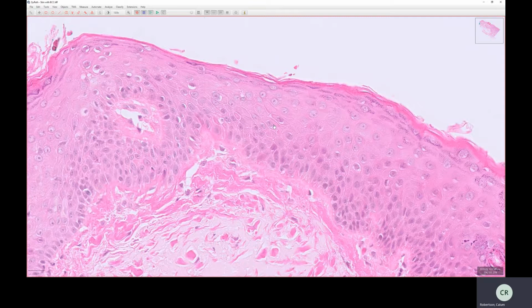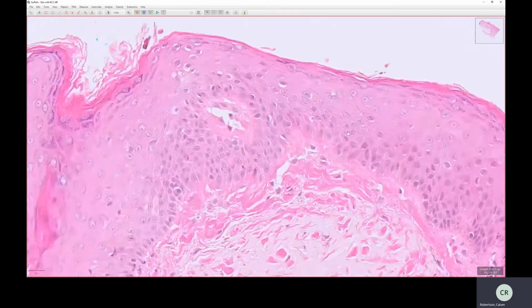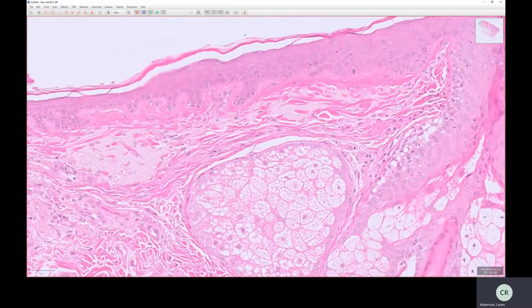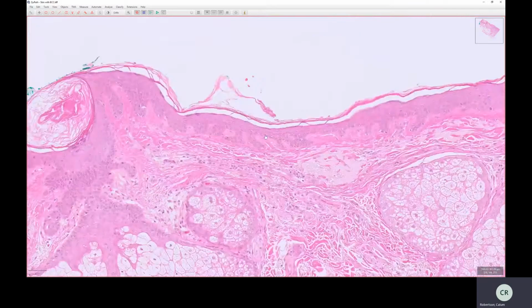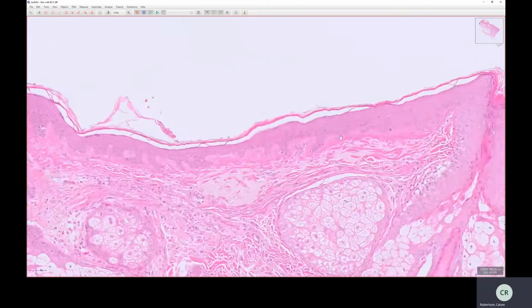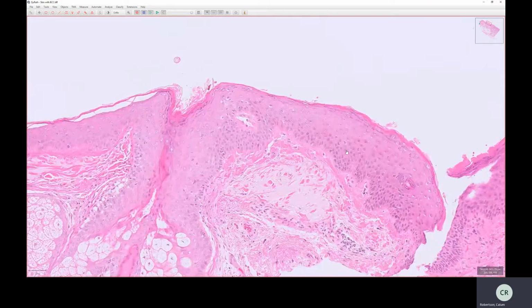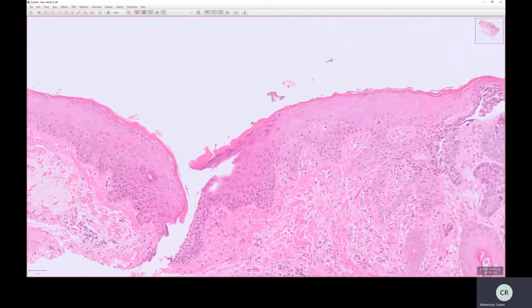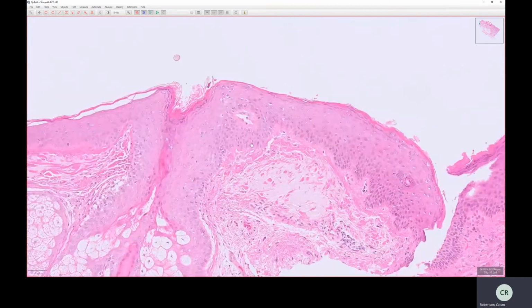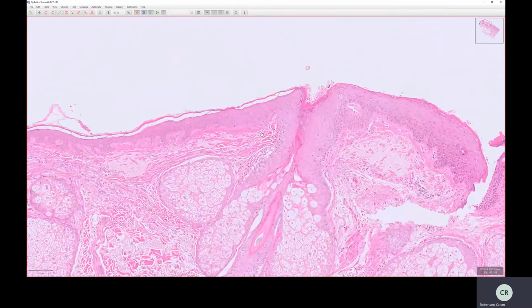And the other main cell type that you've got, you can see Merkel cells. I don't know what they look like. They're indistinguishable on H&E, to be honest. I think you need immuno to really pick them out, but they are there, and I think they help in providing touch sensation. We don't really need to identify them in normal circumstances. They can be responsible for tumors in rare circumstances, but in general, we largely ignore them.